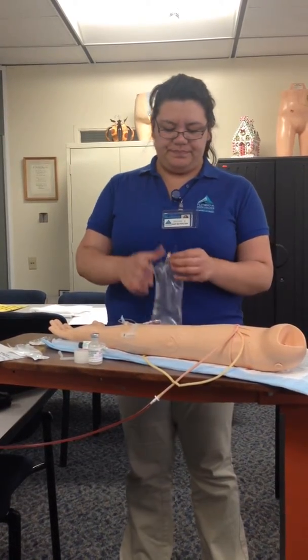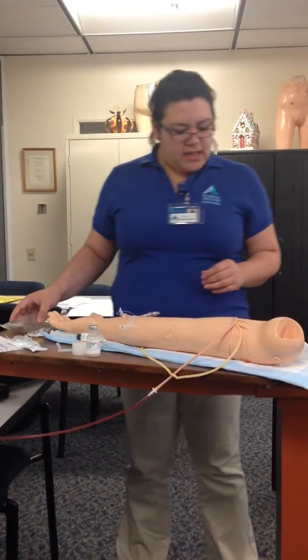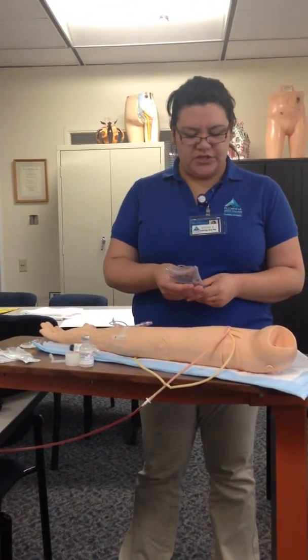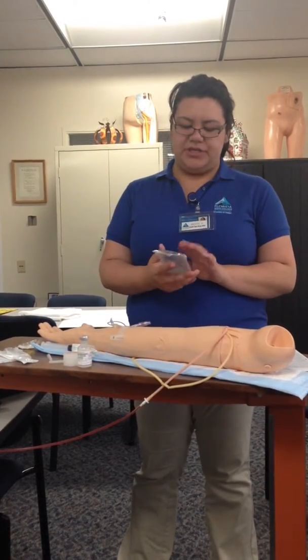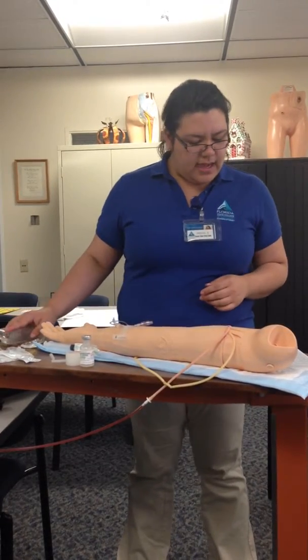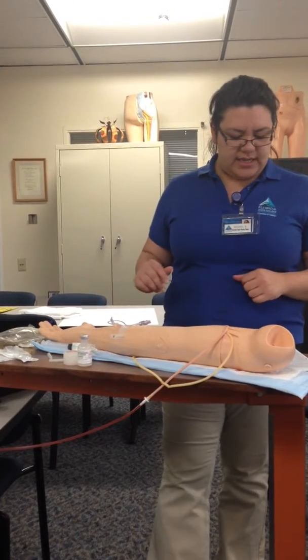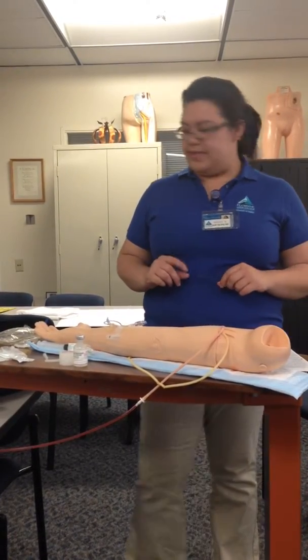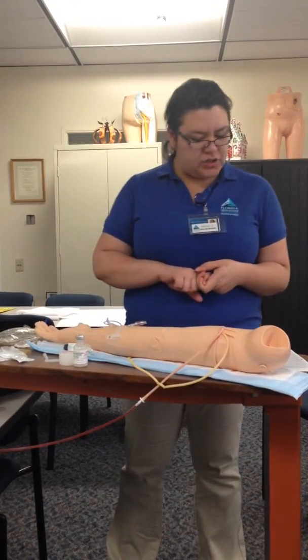I would write on my bag the client's name, the drug, the dosage, the time of the administration, and my initials. And now I will attach the needleless device to the tubing and label the tubing with the date, time, and my initials.